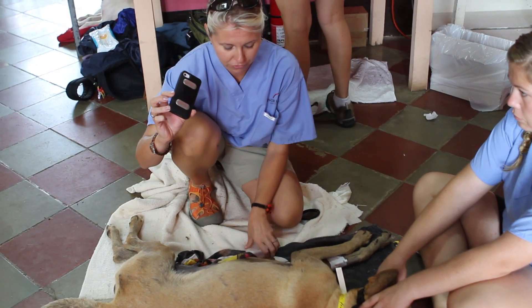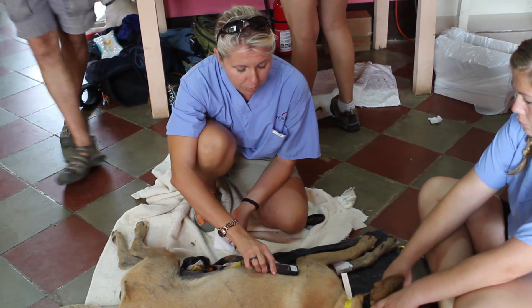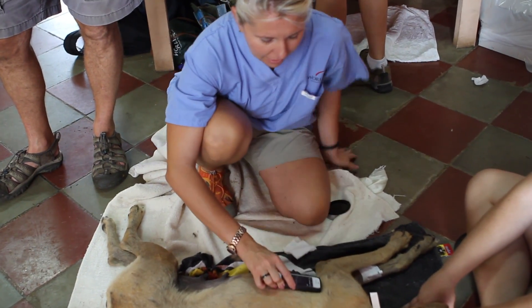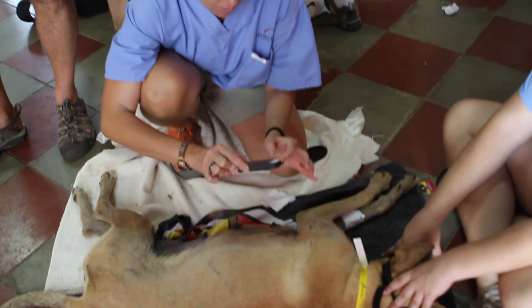It has two little contacts right here. You just wet them down with alcohol — no need to attach any leads. You put it on and it automatically starts to pick up your tracing, and after 10 seconds it'll give you beats per minute and all that good stuff.